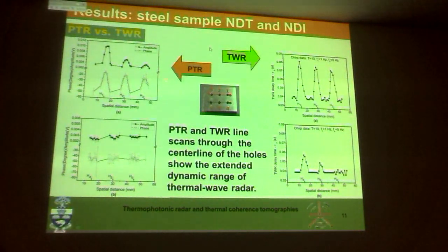But here are, anyway, 3 of those holes, and then the other 3. So you see the 3 narrowest, shallowest holes are okay. You barely see anything like that. But then if you start using the radar principles, suddenly out of 3, you see 3 of them standing up really proud and high, and then the other 2 are also showing up, and you kind of see this one here.